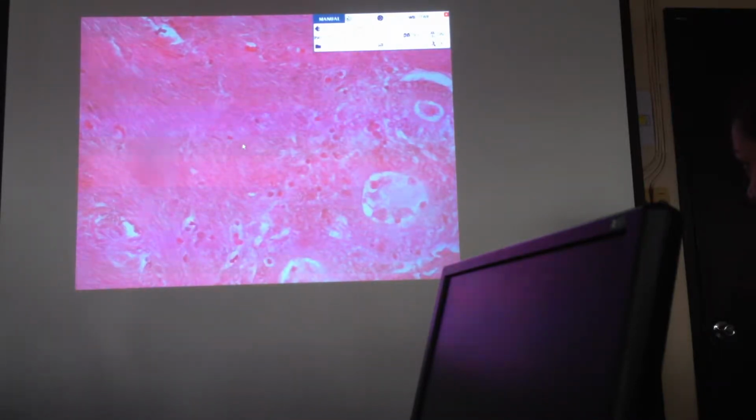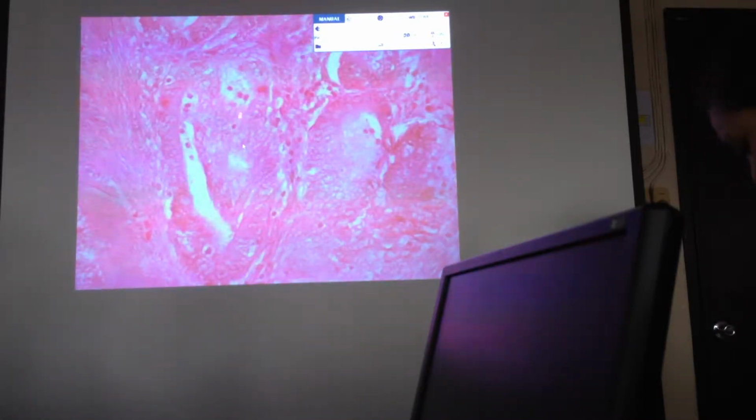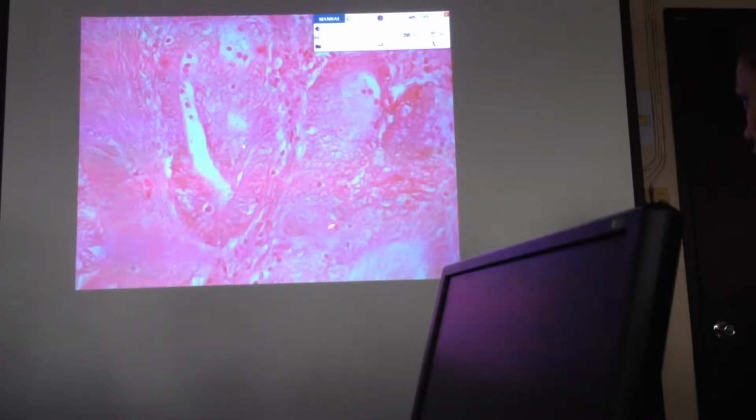Sometimes the endometrioid adenocarcinoma will be confused with one benign lesion or condition, which would be the, alam niyo ba, it's adenomyosis. Okay? Because when we look at the slides, the myometrium would also be infiltrated by islands of normal glands, okay, and stroma. So you have to look for cells that look benign, and aside from that, they are accompanied by the stroma. So in this case, the infiltration here would be by the epithelial cells only, not accompanied by the stroma cells.